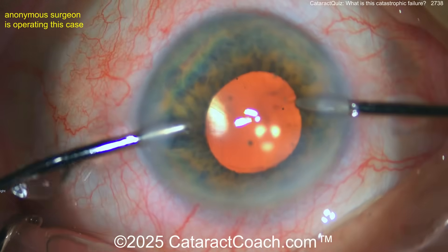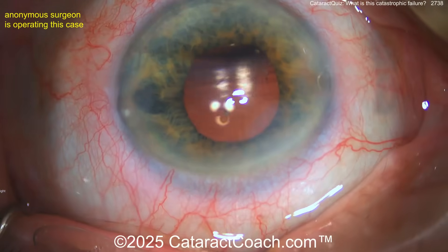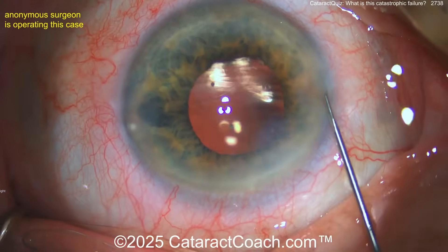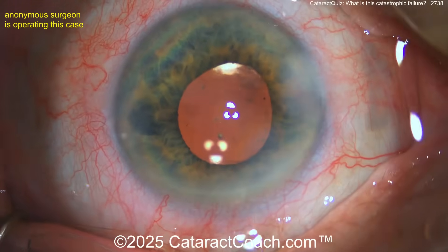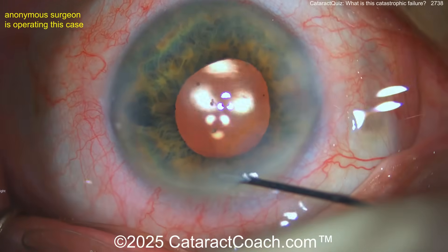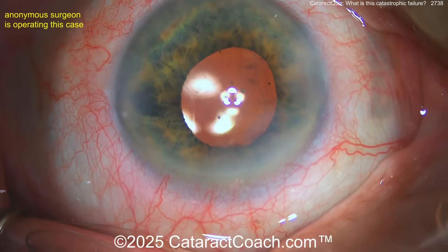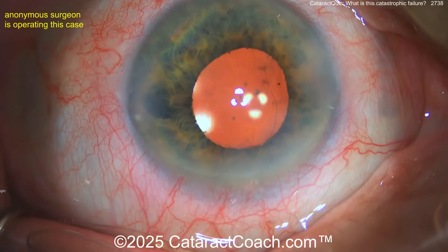Don't go inside the eye anymore. The problem is you're going to cause further dissection. Don't go for perfection — you're done. There's a small Descemet's attachment; it'll be okay, maybe put an air bubble in. But the more you mess with this, the higher the risk. Oh look at that big line now — that's a huge Descemet's detachment, a huge portion now detached.